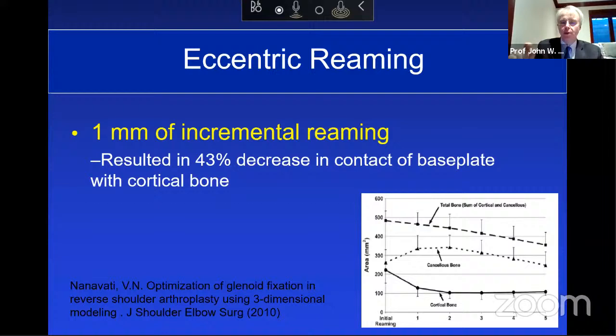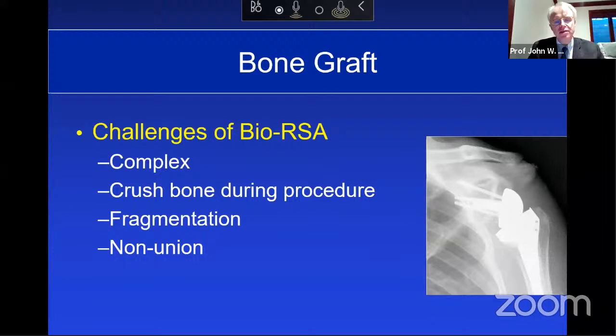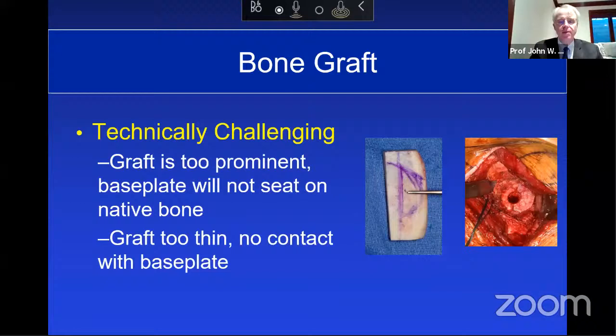How about bio-RSA? This is interesting. I think some of the challenges with this are that it can be complex. You can crush the bone during the procedure, and there is fragmentation as well as non-union. It can be technically challenging. If you place a graft that's slightly too prominent, the base plate will not seat on native bone. And if the graft is too thin, you get no contact with the underlying base plate.